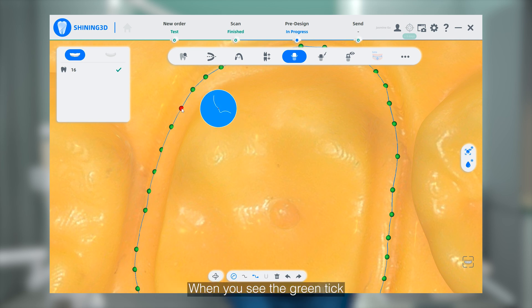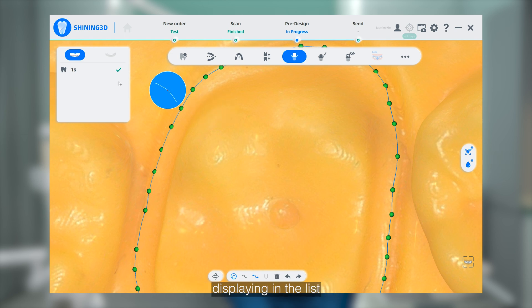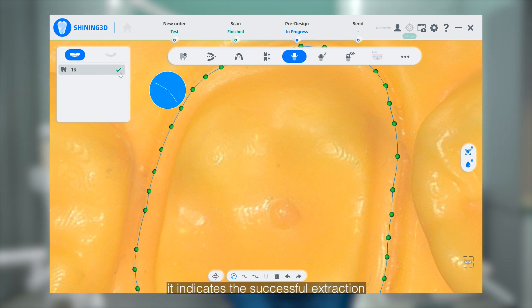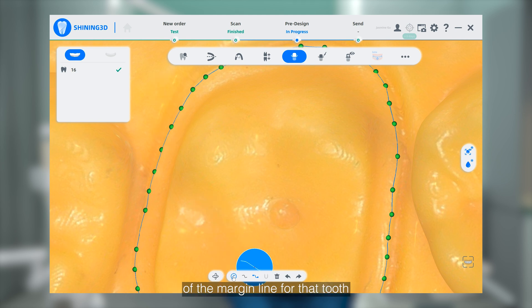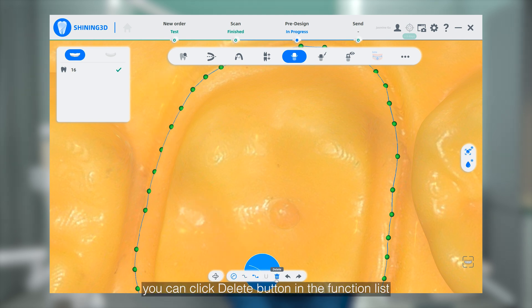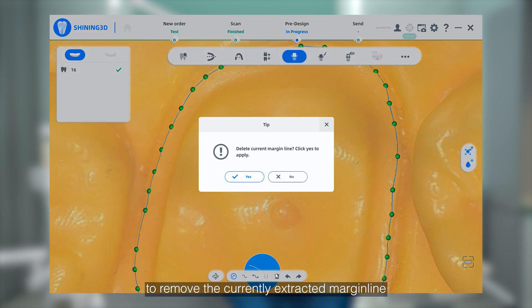When you see the green tick displayed in the list at the top left corner, it indicates the successful extraction of the Marginal line for that tooth. If you are not satisfied, you can click the delete button in the function list to remove the current extracted Marginal line.